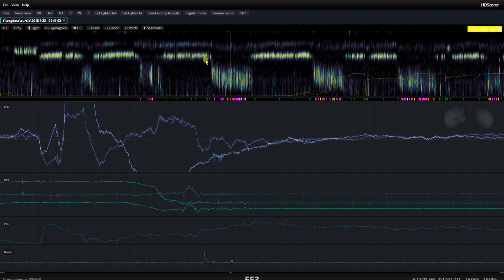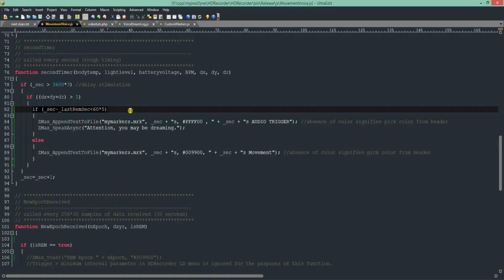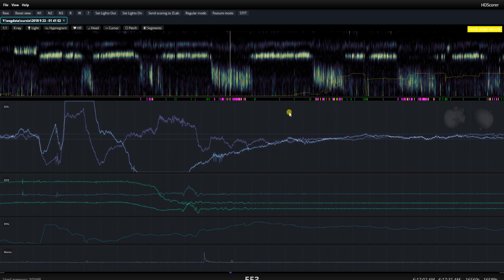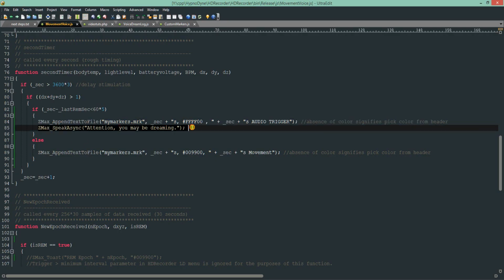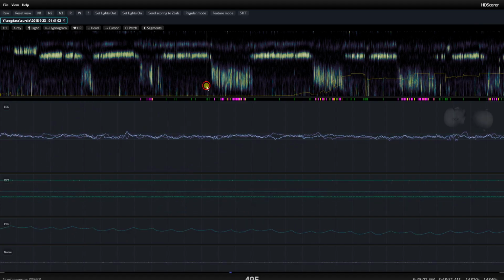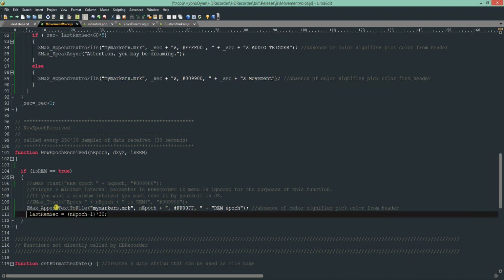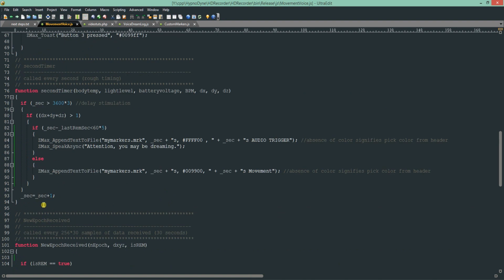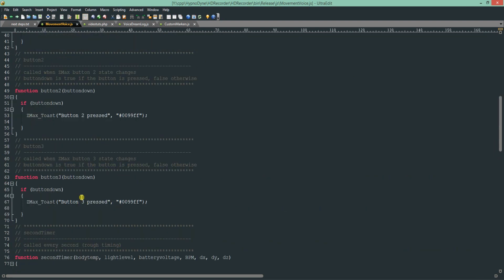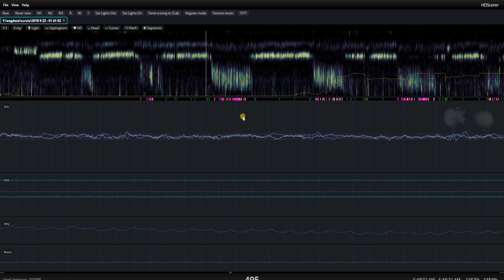Then if the movement exceeds a certain threshold, and also if you're less than 5 minutes from a preceding REM detection, that is one of the purple tags, then it's both going to append the marker with the audio trigger, in yellow, and also it's going to play the audio stimulus. Otherwise, it just adds the tag in green. And that's it. And I only added another line to here to keep track of the REM. So literally this, and these few lines right here is all it takes to realize this kind of algorithm, which I believe is pretty powerful.